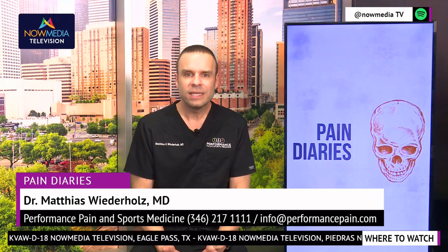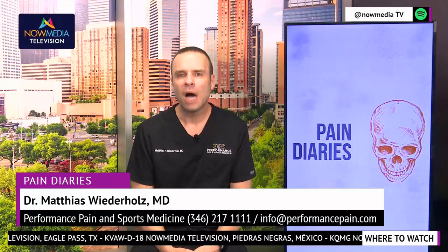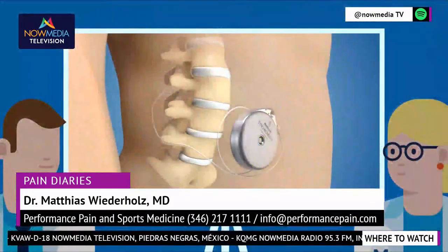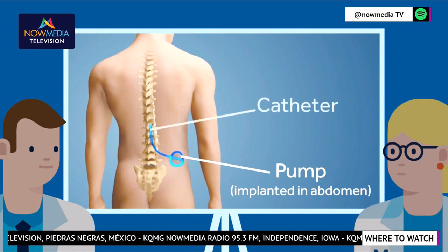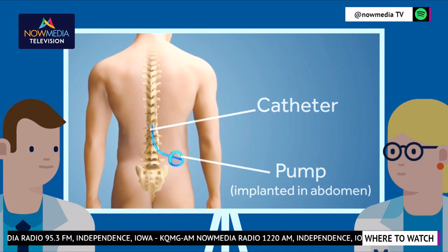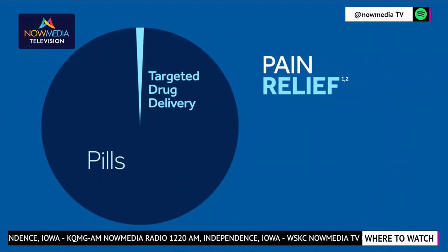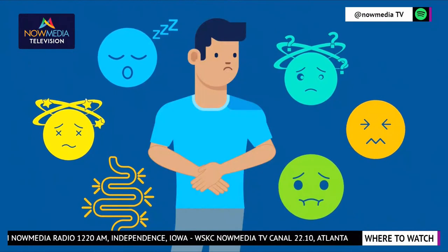Well, it is a surgical procedure to implant. I would say, however, it's a minor surgery. There's no cutting of any muscles. There's no cutting of any bones. So as far as surgery goes, this is not spine surgery. This is not removing tissue. This is simply implanting a device that then has a battery like a pacemaker that goes under the skin. This is minimally invasive. So as far as risks, it's really low as far as surgical risk.